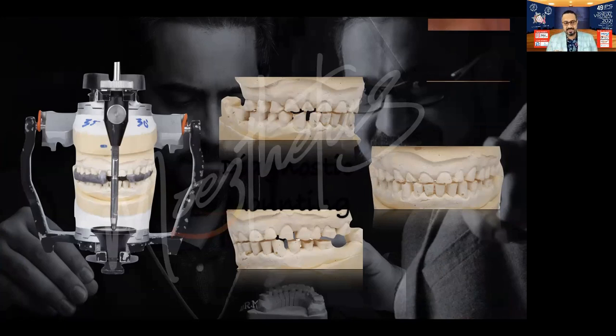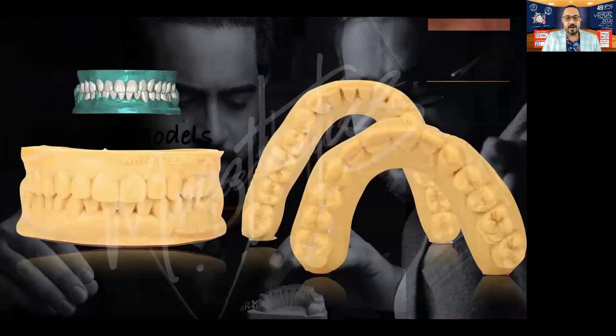We went ahead and did that on the articulator, then scanned it and printed our waxed-up models. This is a digital print and not a basic waxed-up print. But what you get with these models works the exact same way as with waxed-up models — you make putty indices, do your test drives, and then start preparing through those test drives.